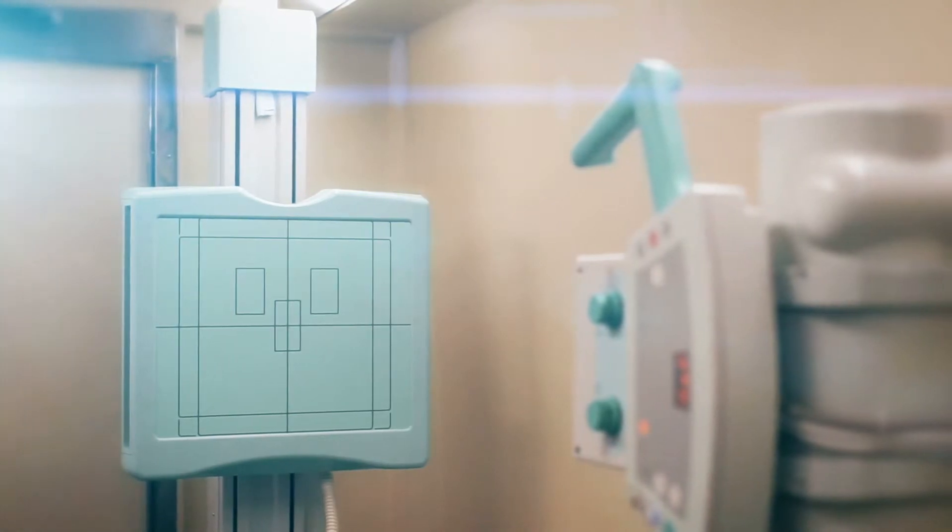An important feature is the ability to switch energy response, which means that you can measure both ambient dose equivalent or air kerma.